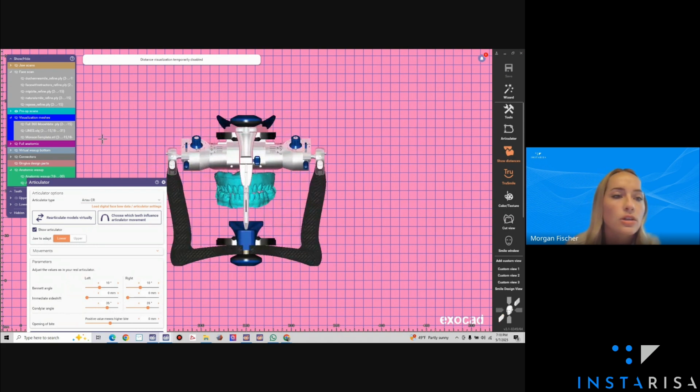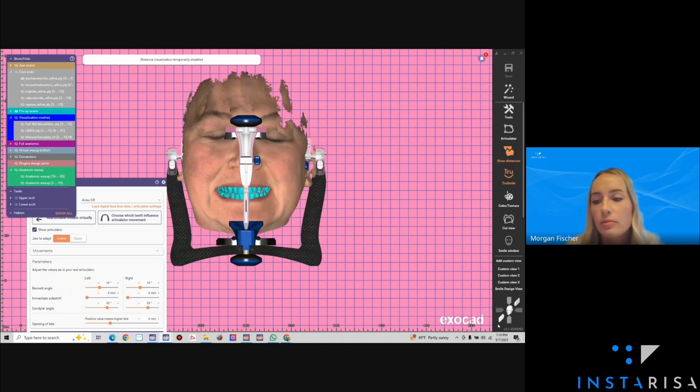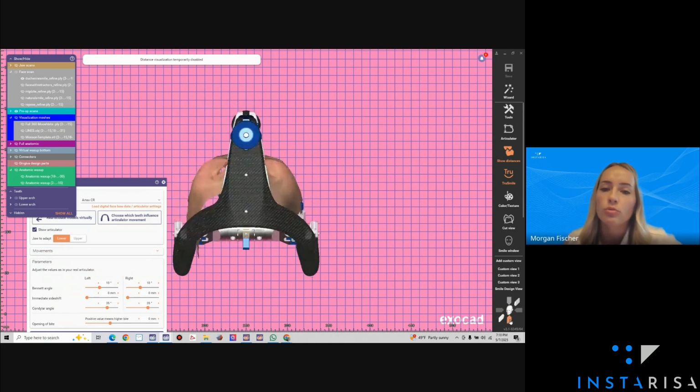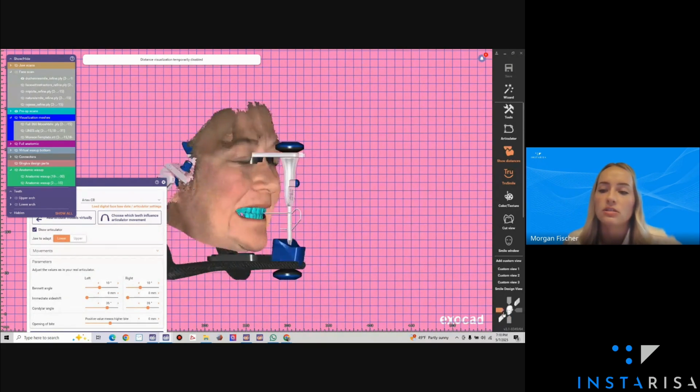Because now that I know, a lot of times the pre-ops that we're getting are extremely canted, overclosed. If I can mount the patient in the articulator using my facial scans, I can see where the hinge axis is at. I can look at different angles. I can look at their profile from different angles, make sure it's not tilted too far.